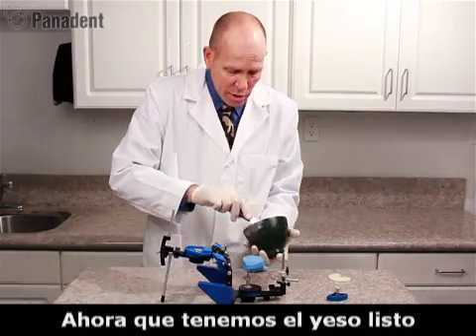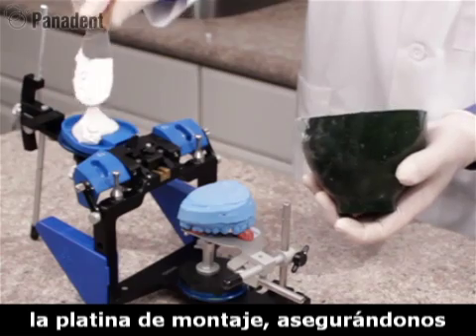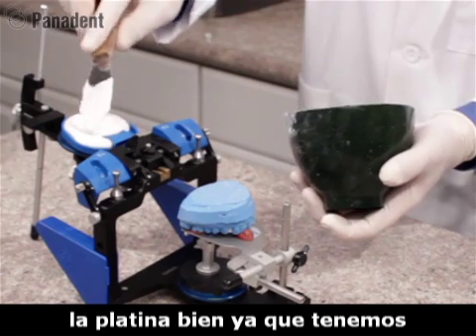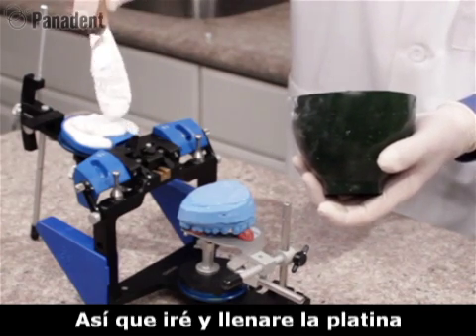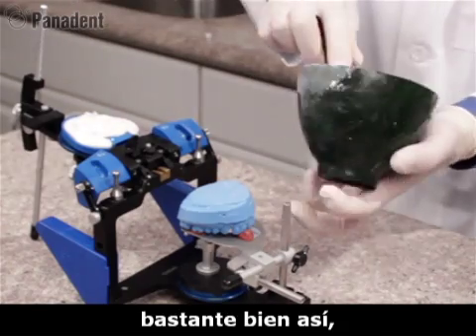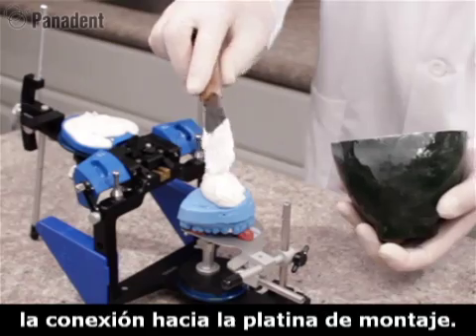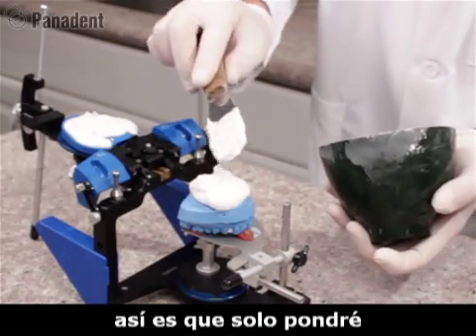We mix the plaster and add it first to the mounting plate, making sure we get it around the center retention lug really well. We fill the mounting plate up fully to engage the retention tabs along the lateral edges of the plate. Then we add a little bit of plaster to the model so we can make a connection to the mounting plate — we don't need too much, just a small dab.